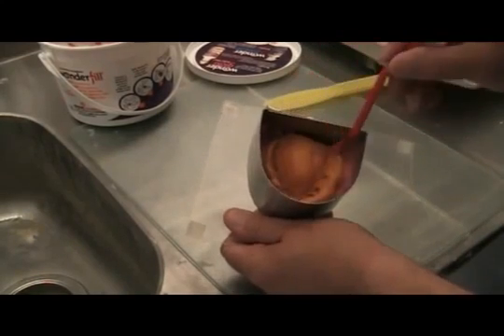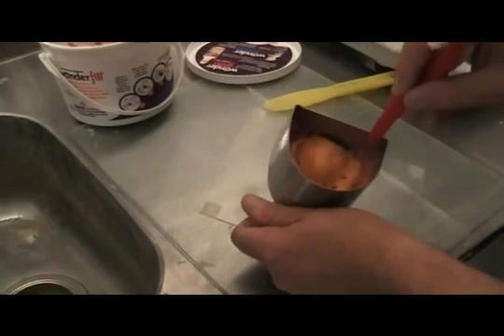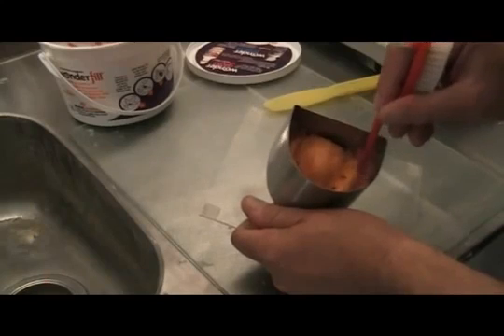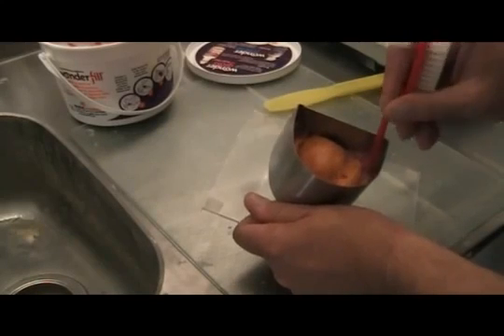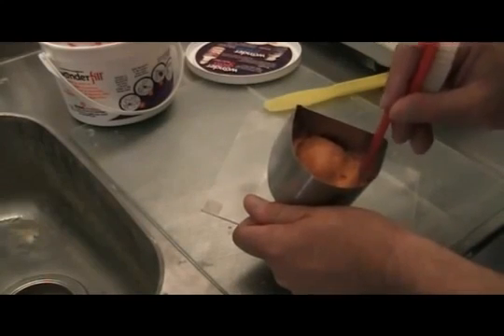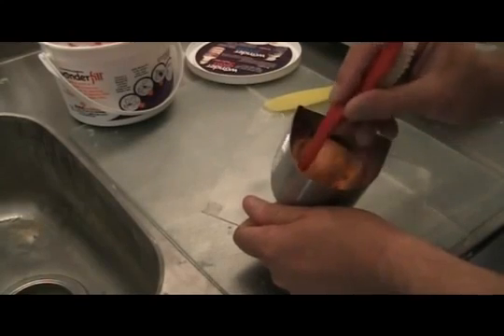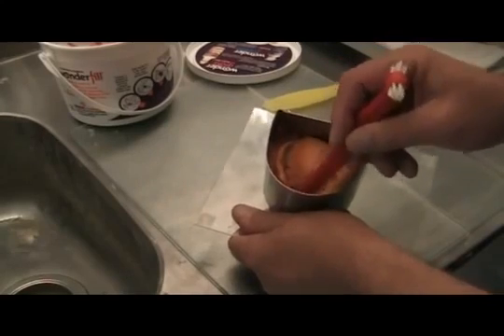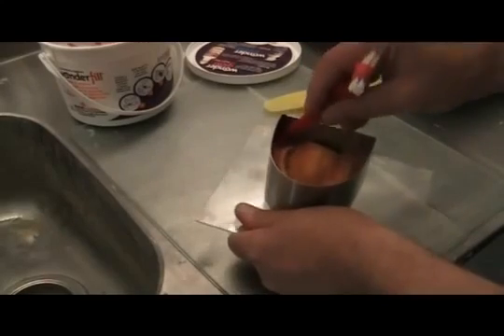And you know, the drawback with that has always been, at least in my estimation, how well the wax sticks to certain impression materials. You could never do this with an alginate impression with wax, but you could do it with Wonderfill. You could actually box an alginate impression if you wanted, or an irreversible hydrocolloid impression, or a PVS impression. Lots of different materials you could use in that regard.